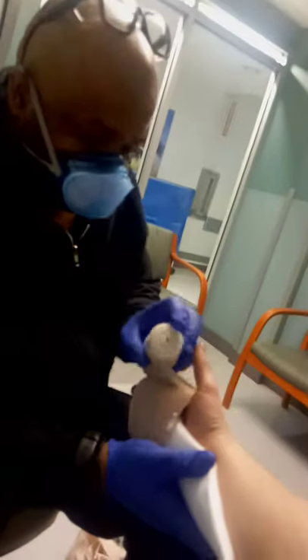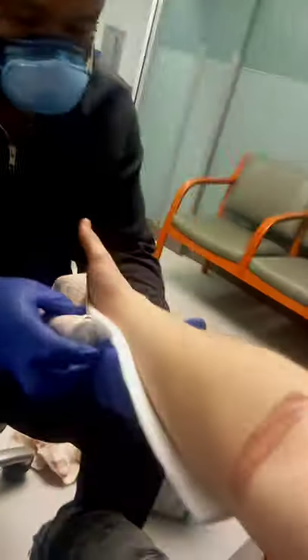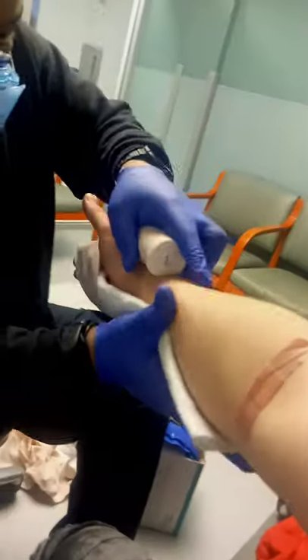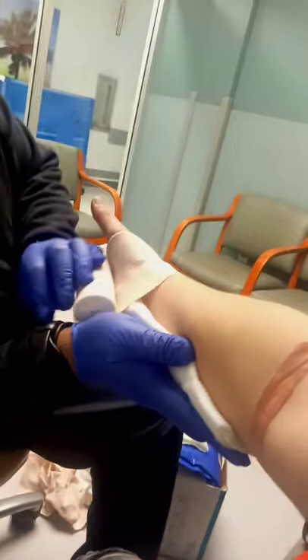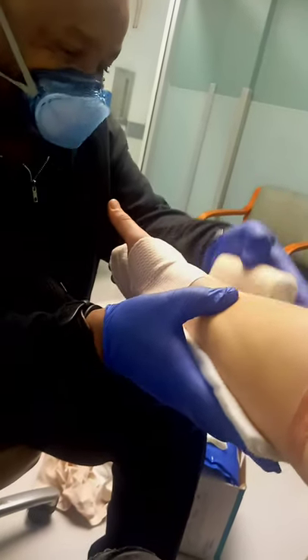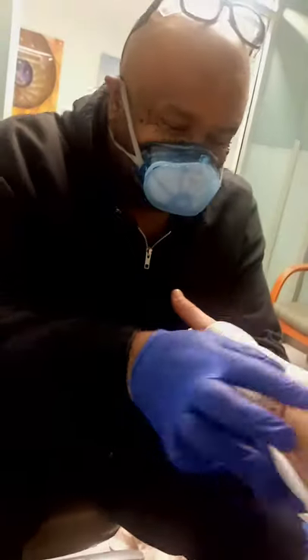This guy's been more than hospitable the moment he saw me walk up that ramp — he greeted me. So this is called an ulnar gutter splint, and this is basically designed to hold your arm in place as much as possible so that you don't hurt yourself any further. The provider is going to explain to you exactly what's going on with your arm so that you have a full understanding.